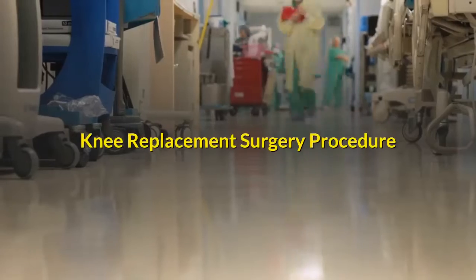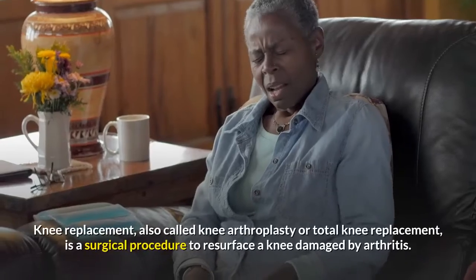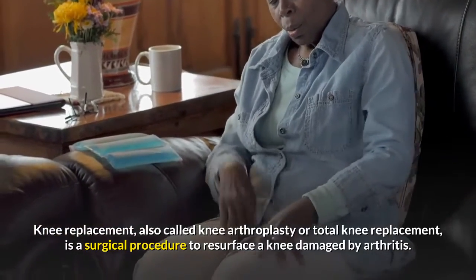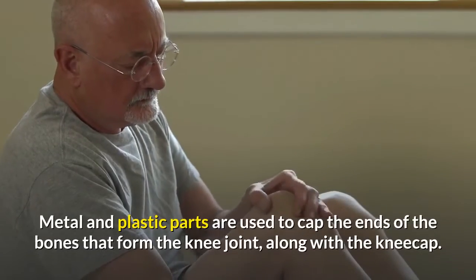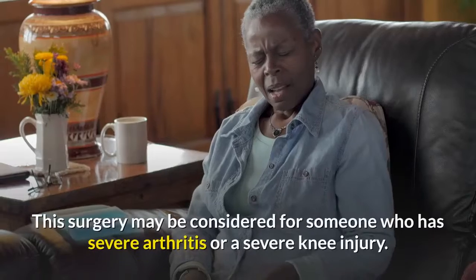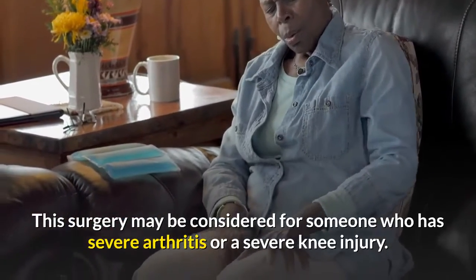Knee replacement surgery procedure. What is a knee replacement surgery? Knee replacement, also called knee arthroplasty or total knee replacement, is a surgical procedure to resurface a knee damaged by arthritis. Metal and plastic parts are used to cap the ends of the bones that form the knee joint, along with the kneecap. This surgery may be considered for someone who has severe arthritis or a severe knee injury.